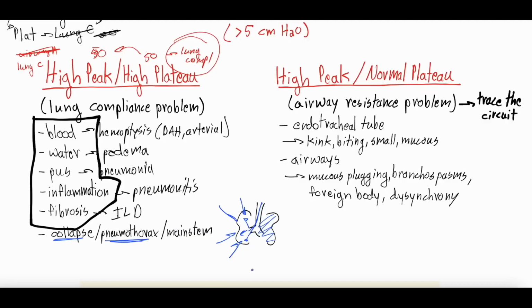Or if you have a pneumothorax, a popped lung, let's say this lung's totally collapsed because there's a pneumothorax. Again, you're just ventilating one lung. And the amount of tidal volume is the amount of tidal volume, right? Let's say you set the tidal volume at 500. That tidal volume is supposed to go into both of the lungs, right? And if it's only going into one of the lungs, so instead of getting 250 and 250, this lung's got a pneumothorax and is collapsed down. That means now you're trying to put 500 cc's of tidal volume in that one lung, and you're going to over-distend it. You can think of it like a balloon again, right? If you're pushing 250 cc's into a balloon and then you try to push 500, the pressure, that compliance it's coming back down with, is going to be more robust.